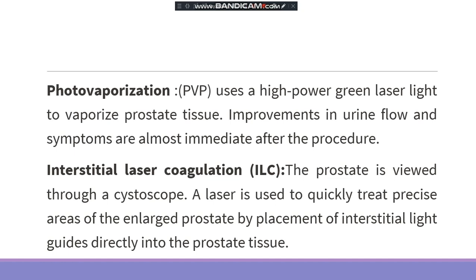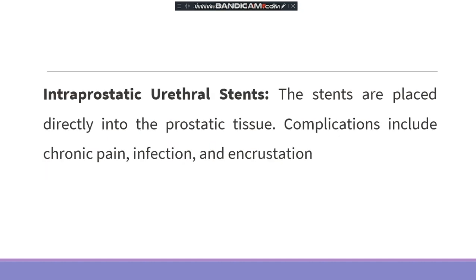So it is comparatively more precise, and the interstitial light will guide to the precise area of the prostate gland where we have to reduce the size, under visualization through the cystoscope.